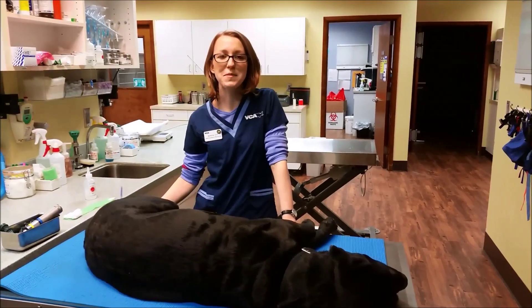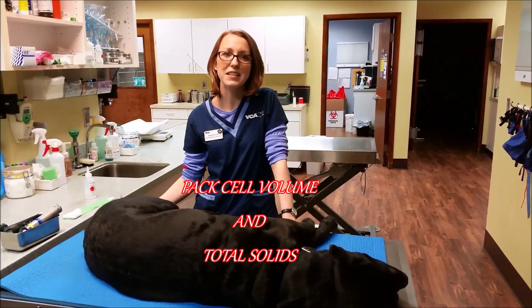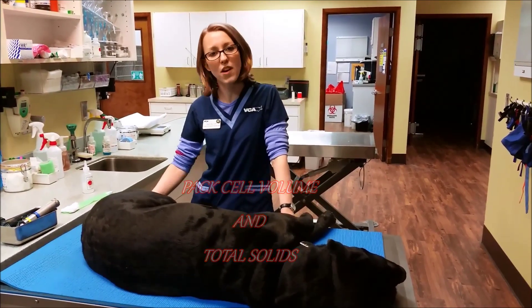Hi, welcome to the VCA Salem Animal Hospital. I'm Camille, a certified technician, and today we're going to be collecting blood for a PCV and total solids.